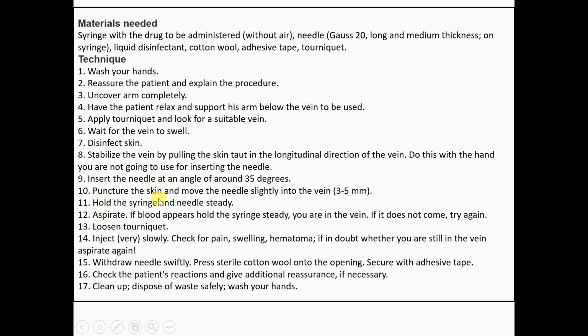Then puncture the skin and move the needle slightly into the vein, about 3 to 5 millimeters. Then hold the syringe and needle steady. Then aspirate. If blood appears, hold the syringe steady and you are in the vein. If it does not come out, try again.